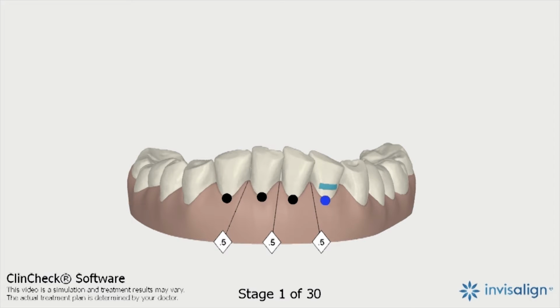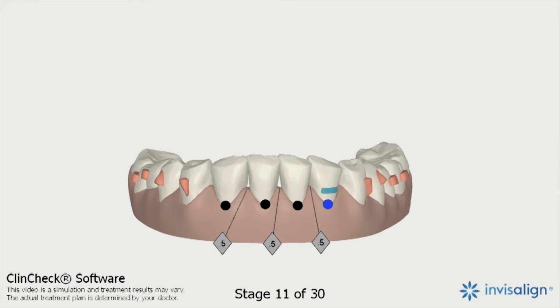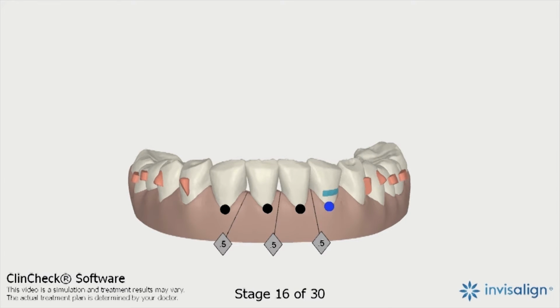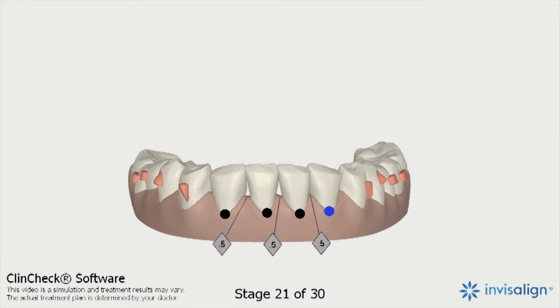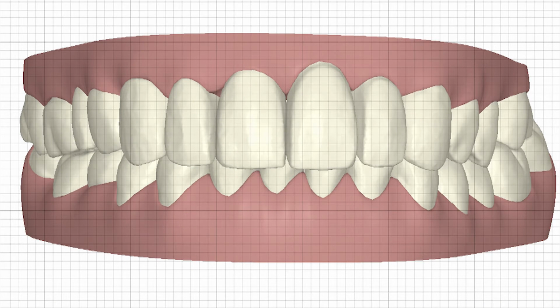Tooth movement with Invisalign clear aligners was the first step of a comprehensive prosthetically driven treatment plan. Intrusion and rotation of anterior teeth are strengths of Invisalign treatment. In this case, the clear aligners helped position the lower incisors in the proper vertical position, correct the patient's occlusion, and reduce the functional forces generated by the eventual implant restoration onto the opposing dentition, preventing the future wear of the patient's teeth. After completion of orthodontic treatment, the incisal edges of the lower teeth were restored with composite restoration.